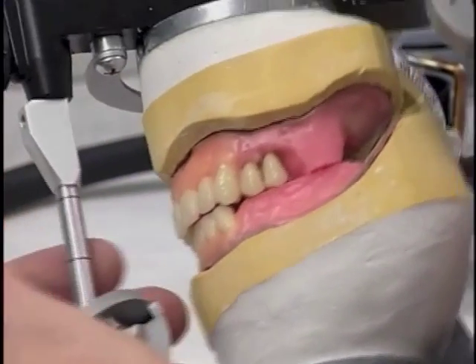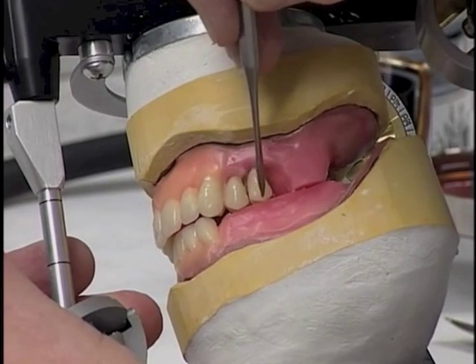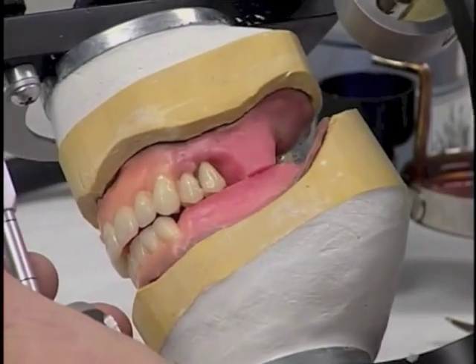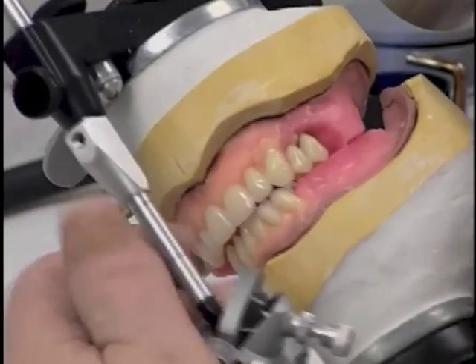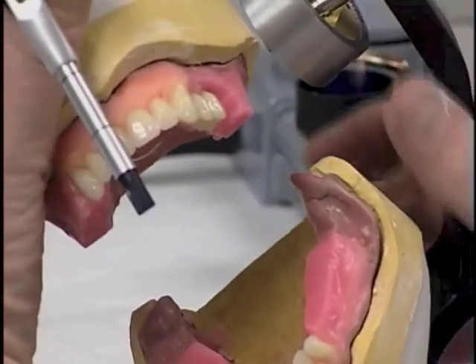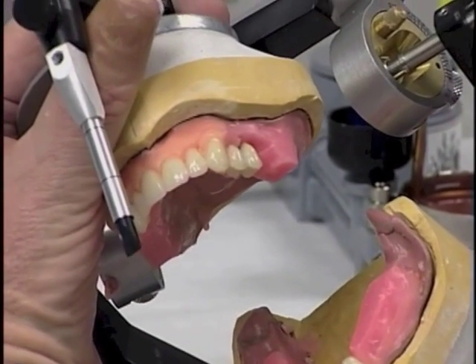Now, it appears to be at virtually the same height as we come across now as the first premolar. The long axis of the tooth should be vertical, at a 90-degree angle to the occlusal plane. And now that we're at the second premolar, what we really would like to see is the beginning of a little bit of curvature to our occlusal plane.